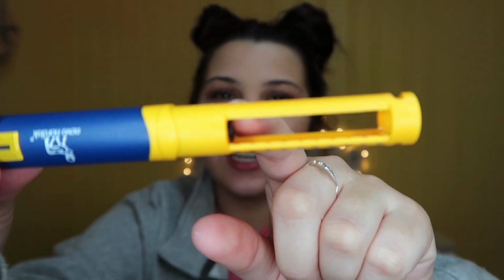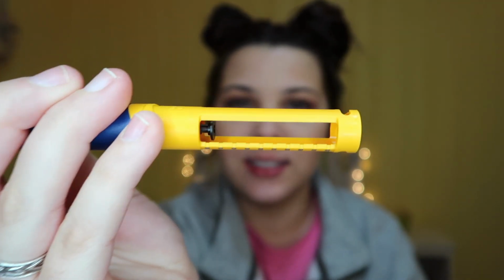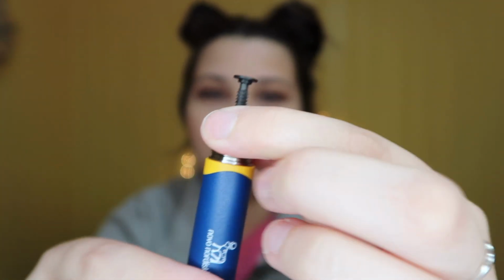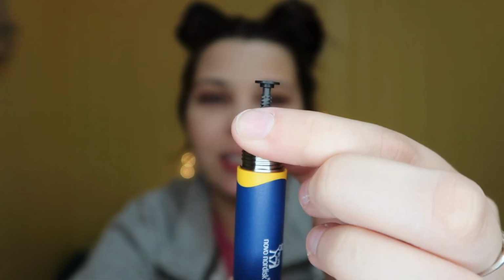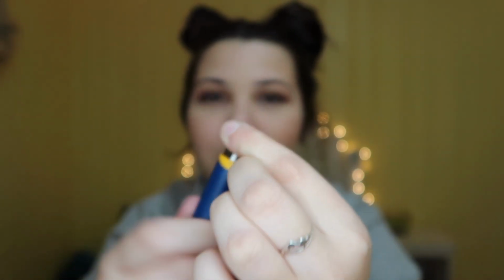One thing that you did have to do with these, which was kind of interesting, is once you finished a cartridge, I don't know if you guys can tell, but there's a little metal black piece right in there, and if I push this, it moves. Let's say you got to the end of the vial, what you would do is take this little orange piece and twist it, and it would lower that little black piece all the way down. So that is how I used to take insulin before I got my pump.